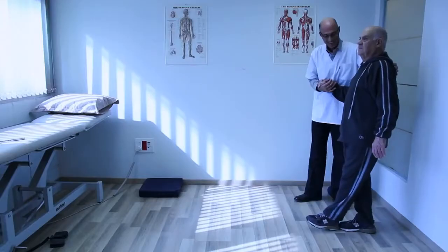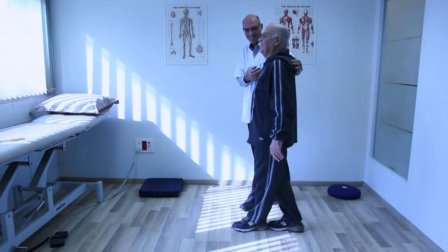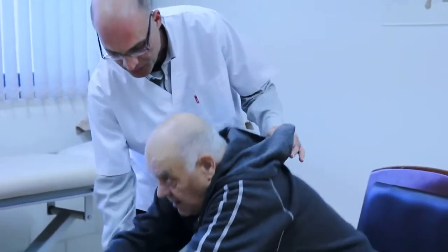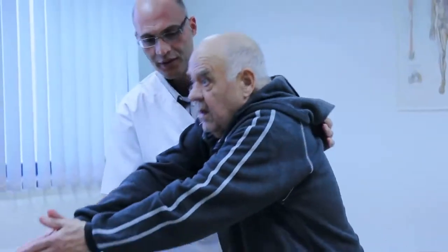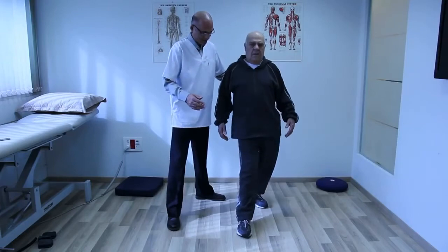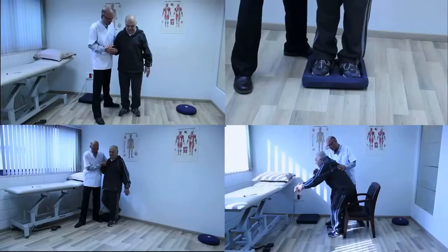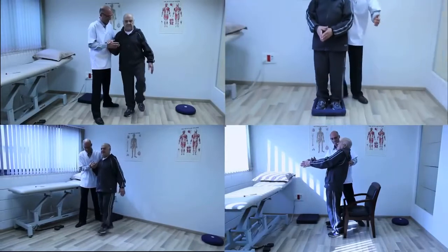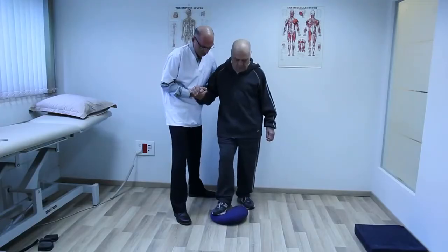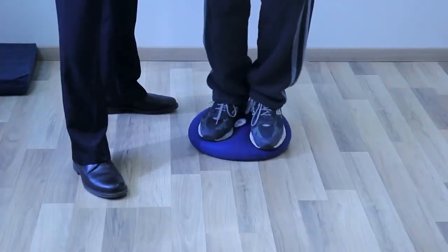In addition to aging, both neurological and orthopedic injury and disease may affect postural control responses. Despite the critical importance of unexpected perturbation in balance therapy, traditional therapy can only use expected perturbation. This is because of the lack of both safety and treatment customization possibilities.